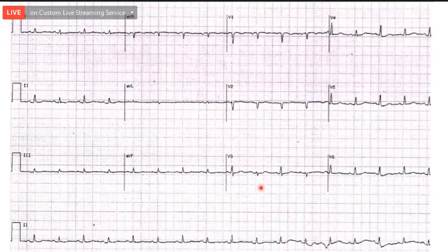Pericardial tamponade. For cardiac tamponade, ideally you need the total electrical alternans. But this patient actually had a cardiac tamponade. So this massive pericardial effusion, the low voltage complexes, and alternans. If it is total electrical alternans, you are 100% certain. But even presence of QRS electrical alternans along with the very low voltage complexes, I think you should suspect the possibility of cardiac tamponade. Okay, very good. Yes.